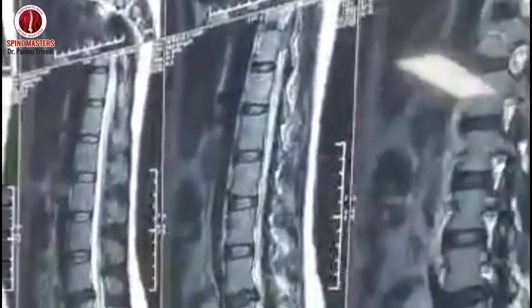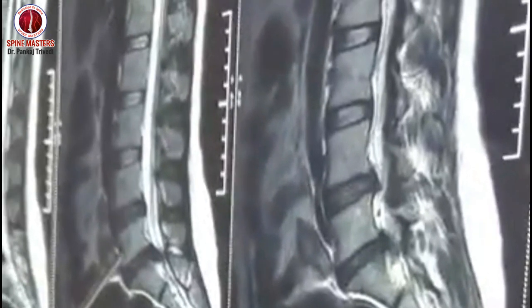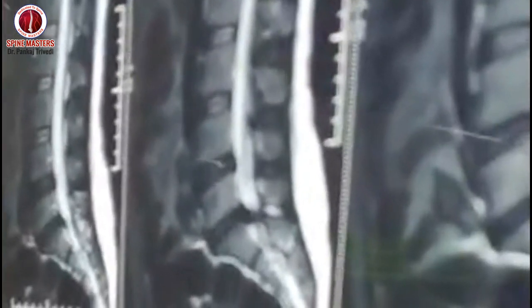Now you can see here, these are the sagittal cuts. You can see there is a very big fragment at L5S1. A downside migrated disc is there, right? I can see a fragment here. Now in the axial cut, you can see this is a disc bulge. This is a root, and this is a big fragment lying here.